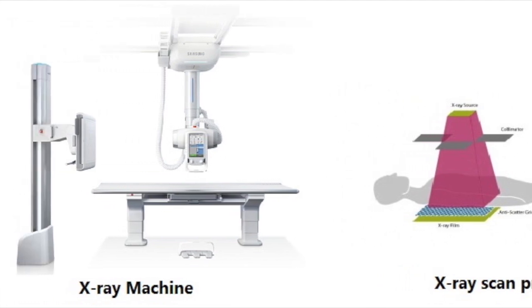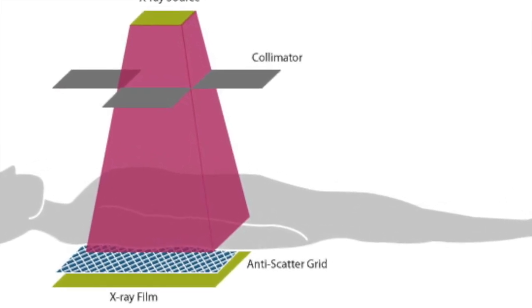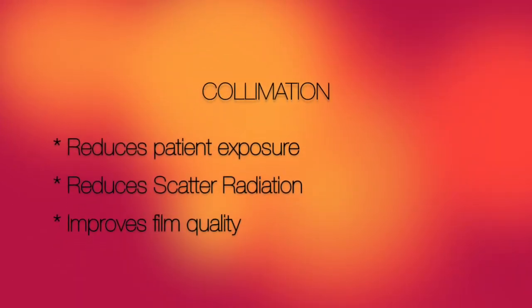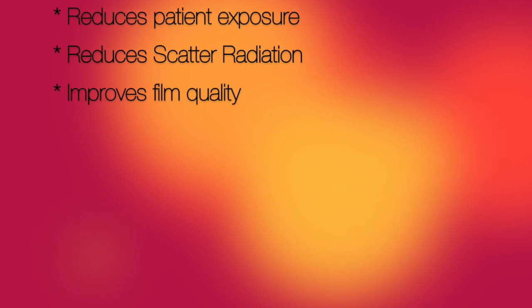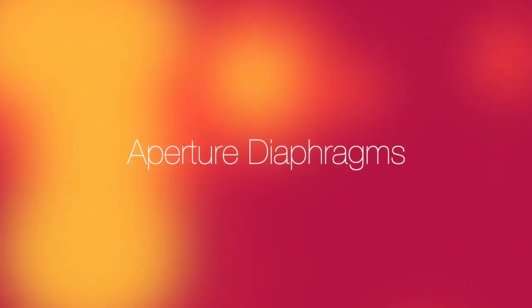Collimators affect the number of X-ray photons reaching an image receptor as well as a patient. Increasing collimation decreases the number of photons that strike the patient, also decreases the amount of scatter radiation that is produced, and reduces the quantity of scatter radiation. In return, radiographic contrast increases. If collimation is decreased, the amount of scatter radiation increases and contrast decreases.